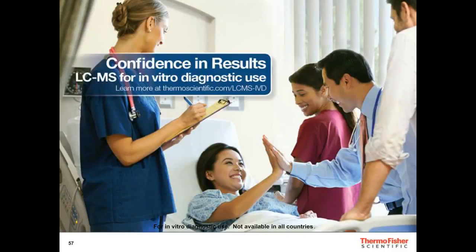All right. It looks like we have time for one more question. So it is, what are the flow rates again? Sorry if I missed that. Joe, can you answer that question? Yeah, the Prelude MD HPLC, as well as the LX4 version, is capable of going from 10 microliters a minute up to 2 milliliters per minute.